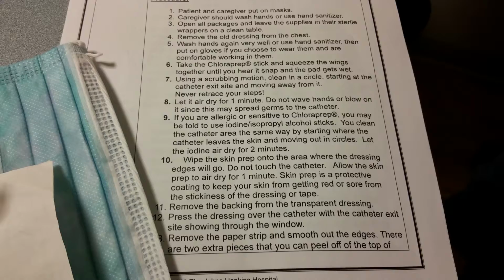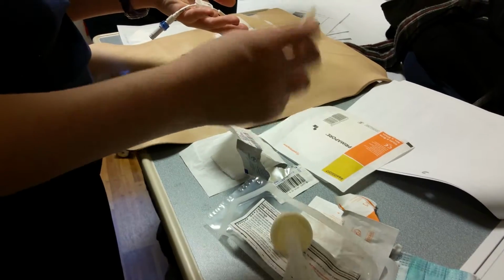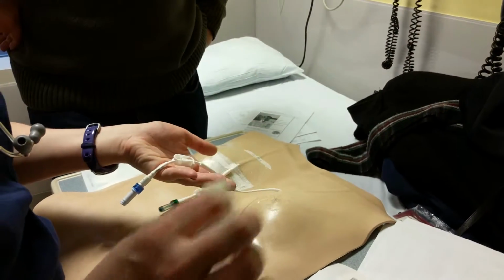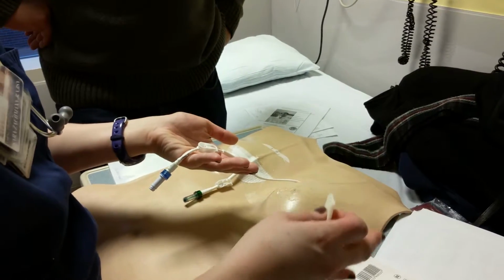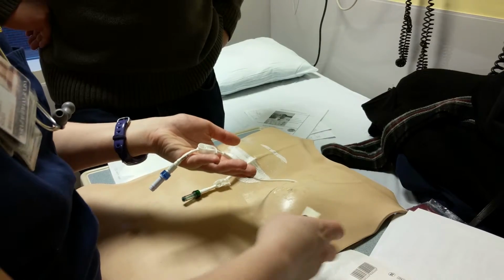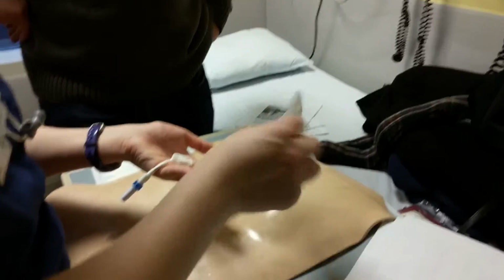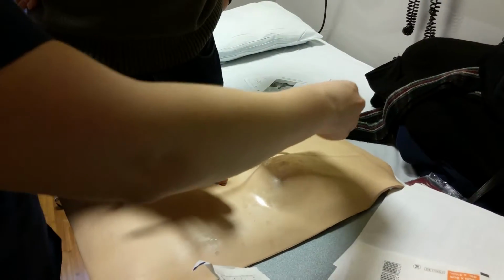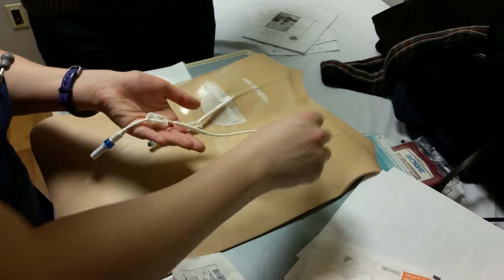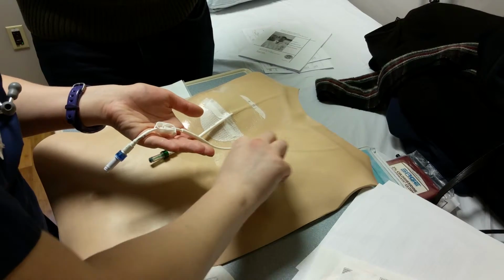So once this is fully dry, 60 seconds, I've got my skin prep, which is the sticky sponge, and I'm going to paint like a window around where the edges of my dressing are going to go. So I may have to put this down and take my dressing and estimate how I want it to go, where I want it to go, so that I can start to paint a window.